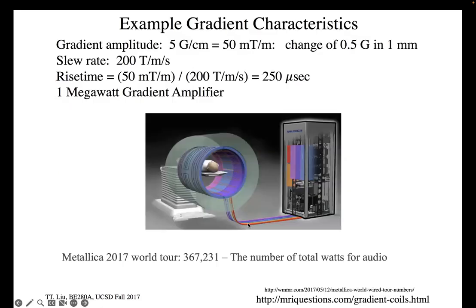Okay, so let's move on. Here is a cartoon of the 3 gradient coils and where they are in the cylinder. So the magnetic field coil windings are out here, and then inside those are the coil windings for these gradient coils. And they are connected up to an amplifier. What the amplifier does is it provides current to these gradient coils in order to make a magnetic field.